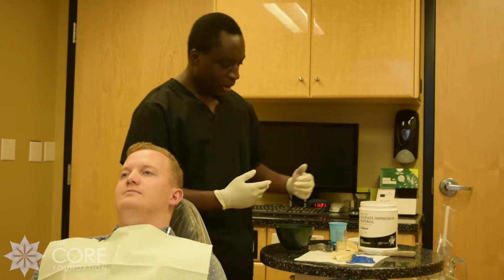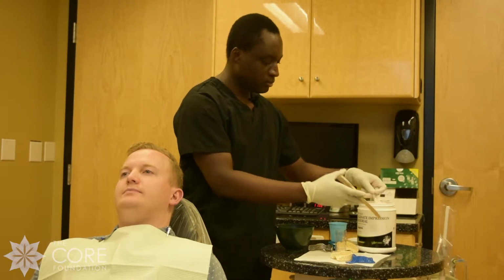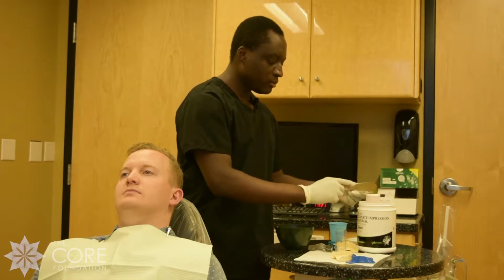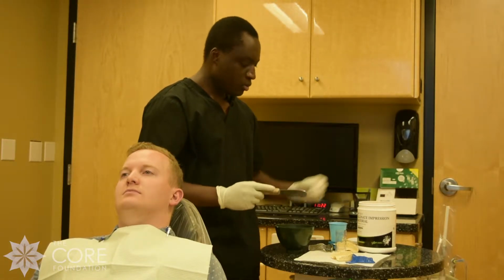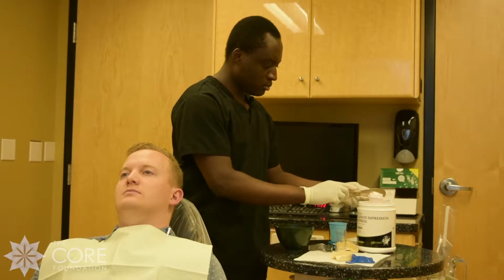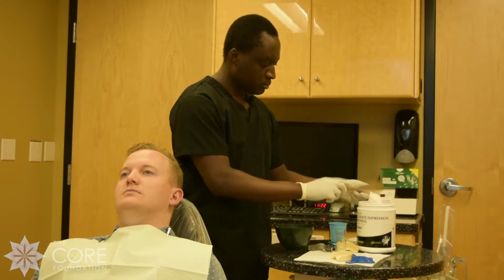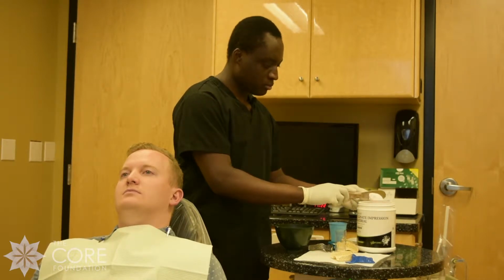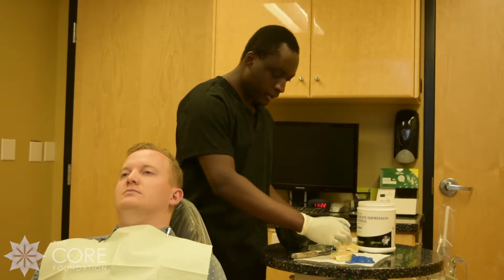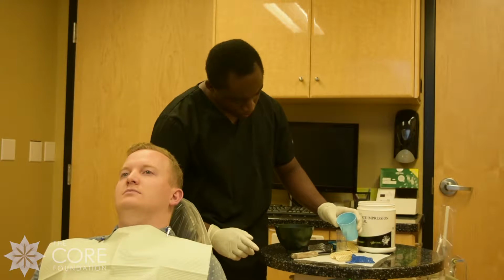So we're going to be taking the top first. What we'll do is fill it up. 1 scoop. 2 scoops. And then number 3. Okay, so now it shows for 3 scoops, our water has to be all the way to the top. So we'll just slowly fill it up.